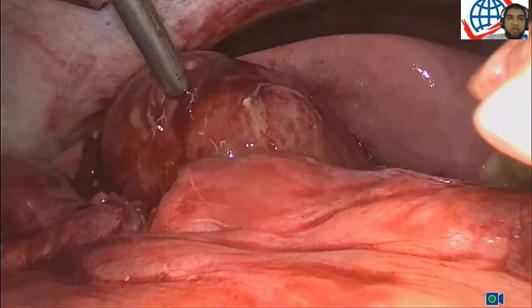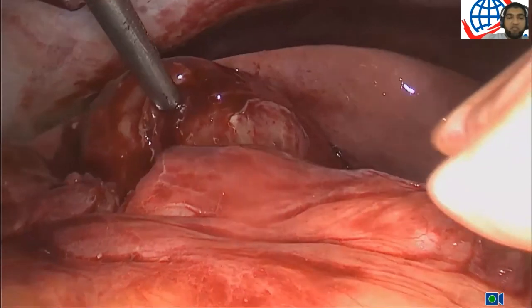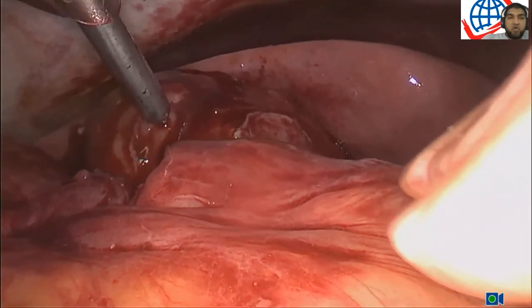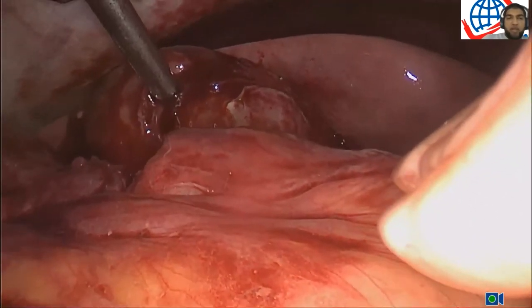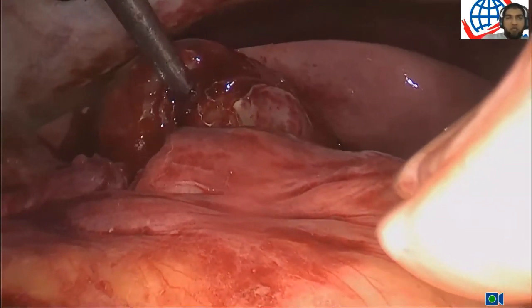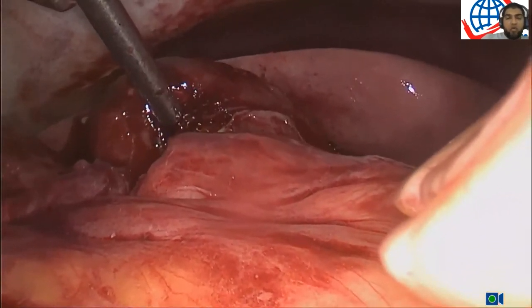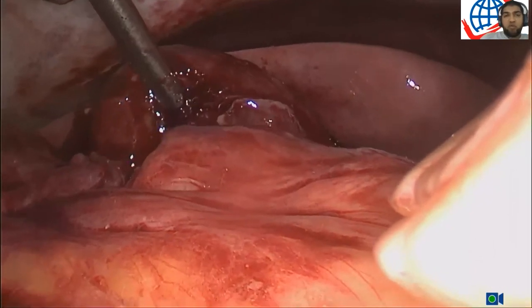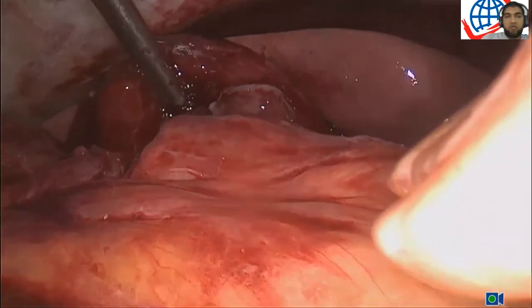Okay, guys, whenever you're doing this part of the operation, always make sure that the aspiration needle comes in under view of your camera. Do not blindly insert the aspiration needle. And also, it's not only to decompress the gallbladder so that you get traction on it, but if it's a case of a gallbladder empyema or you think the bile is infected, we send some of the bile or the pus away for microbiology. And suck as much as you can out, not only to get traction, but decompress the gallbladder as nicely as you possibly can. And this will help you in case you enter the gallbladder later on. It will also help you to contain the sepsis from the gallbladder.